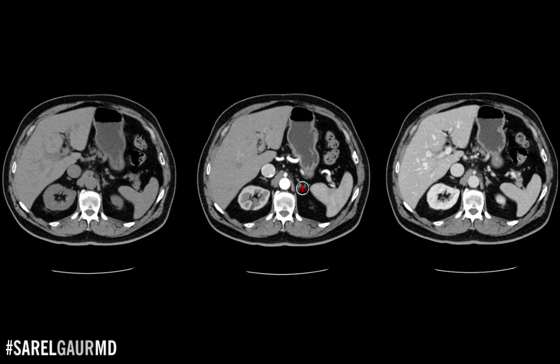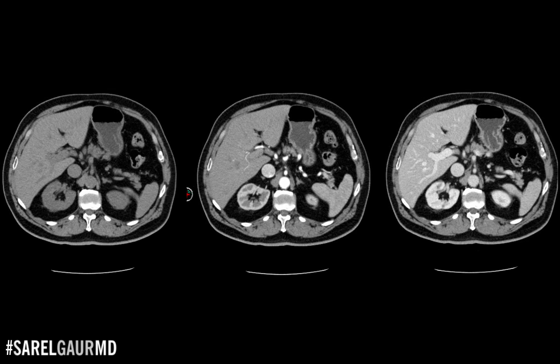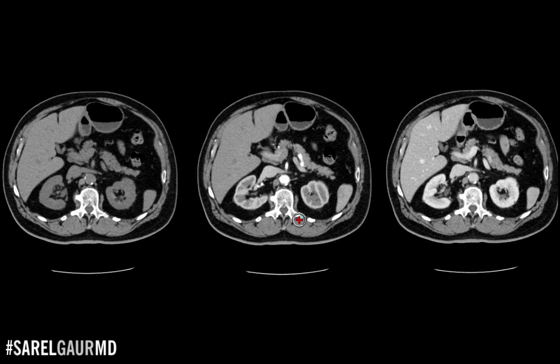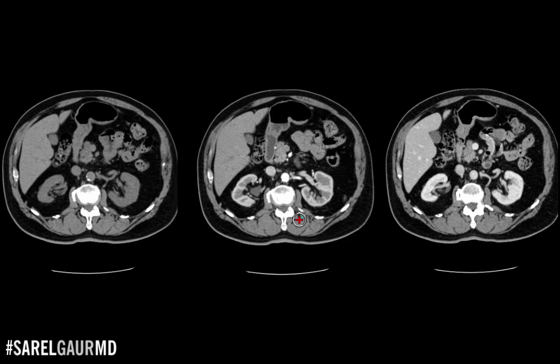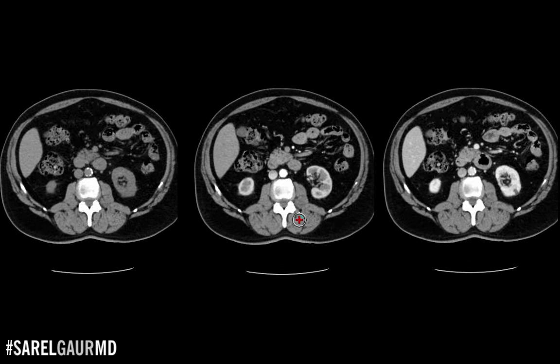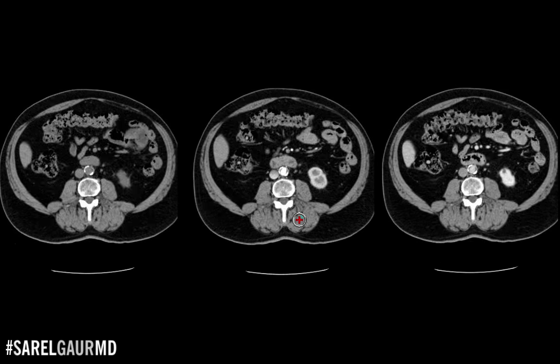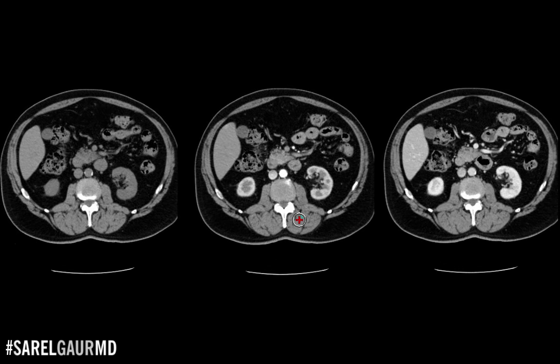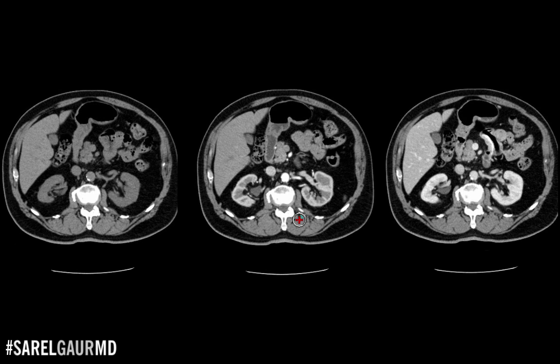For reference, here I have three CTs of the abdomen. They all look sort of similar, but they also look sort of different. And that's the point — I'm trying to explain the different phases of intravenous contrast in CT.